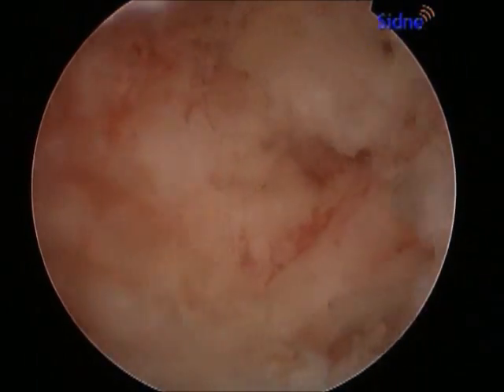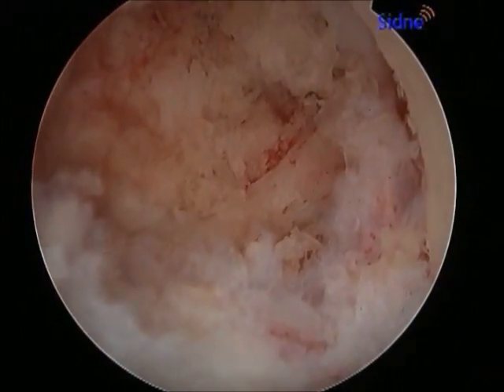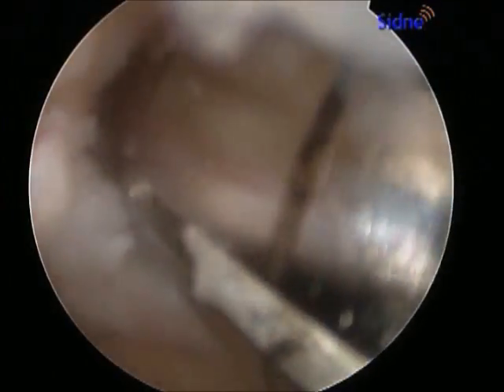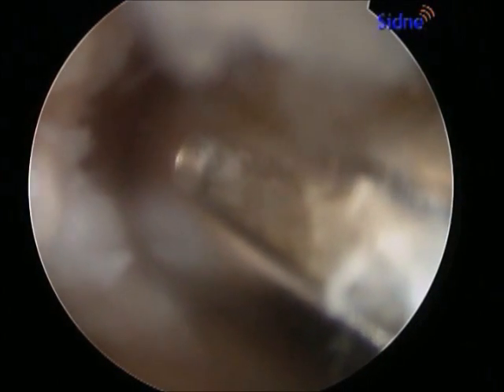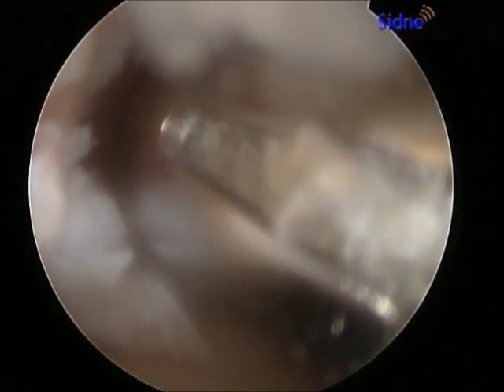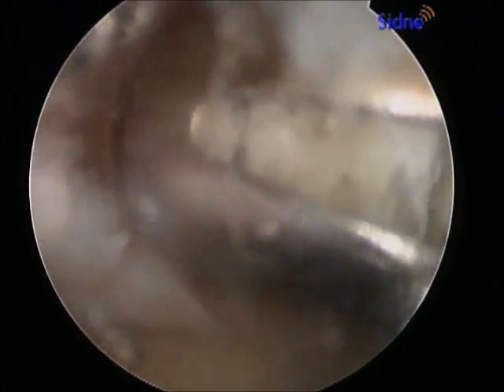About half of the cyst is filled at this point and another tube of bone graft will be required to fill the cyst completely. The second tube is brought in and again the slotted portion of the cannula allows visualization of the bone graft as it is being tapped in and compressing into the cystic cavity.